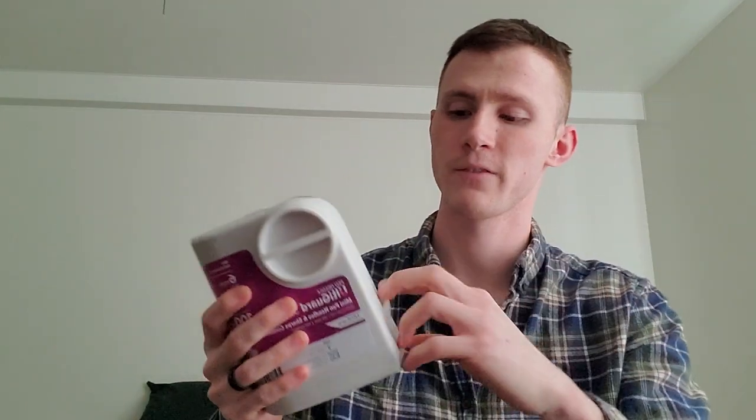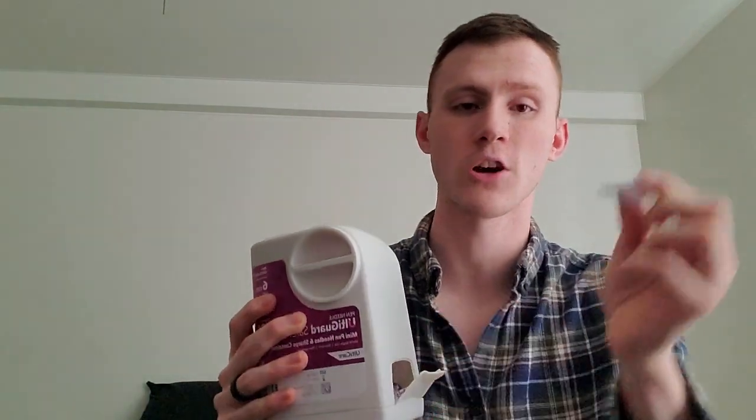So what you're going to need, of course, your insulin pen. You're going to need some alcohol wipes. You can just get these at the store. And then you're going to need a needle container for after you're done using the needles. And then also, for me at least, this gives me fresh needles as well that I use with my insulin pen. So I'll show you how all this works, at least all of this gear. It's pretty easy, pretty self-explanatory.